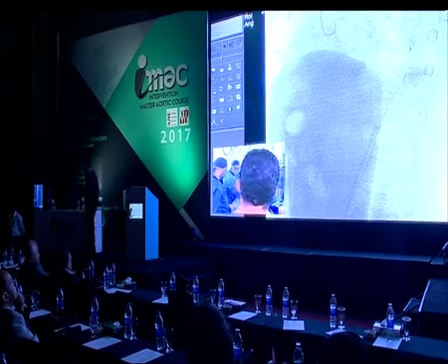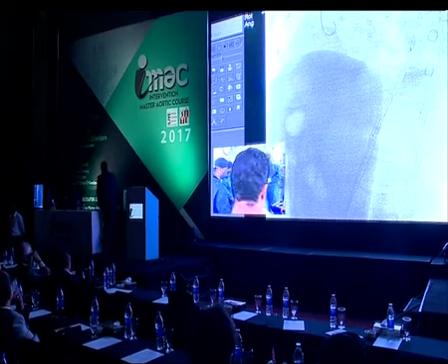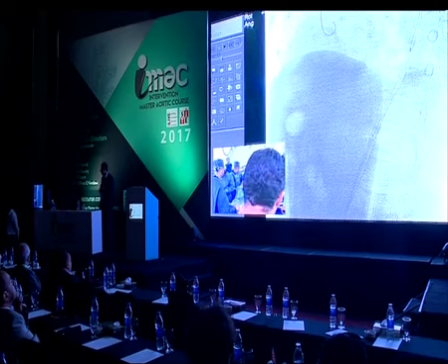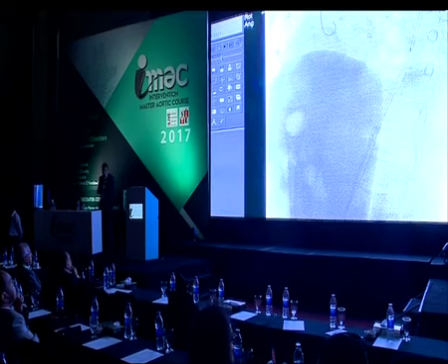Now you have changed your projection. Would you like to do another angiography before deployment? As a rule, for any deployment near the arch, we should lower the blood pressure, maybe to 80 or 70 systolic. But you have to have a good anesthesiologist to control this.